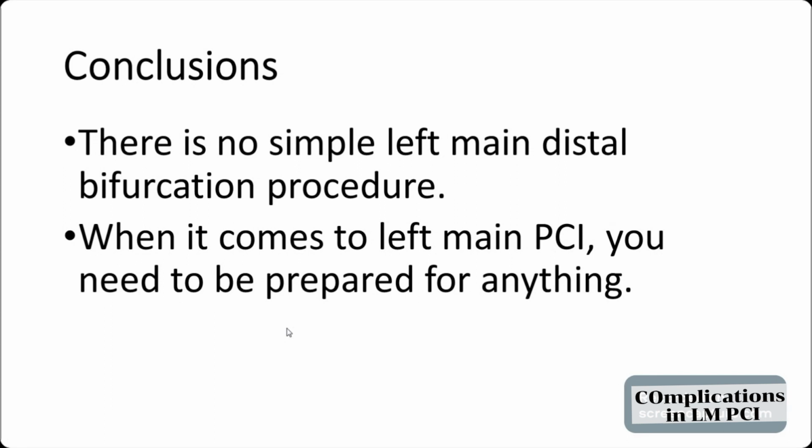My conclusion is there is no simple left main distal bifurcation procedure. When it comes to left main PCI, you need to be prepared for anything, and it has massive effects on hemodynamic parameters. You need to be quick to treat no-reflow and anticoagulation problems because collapse may occur soon.